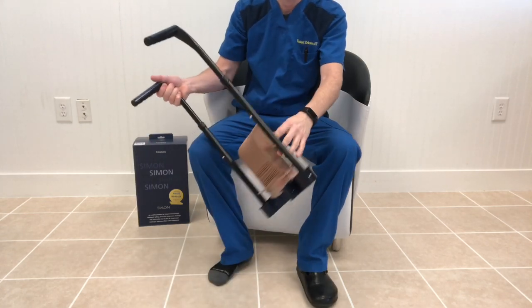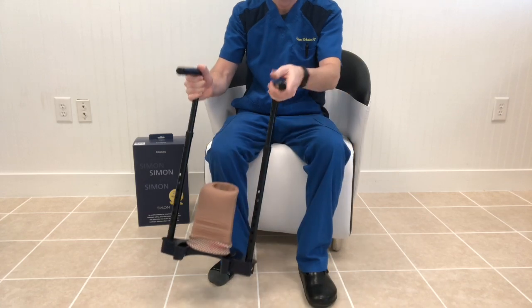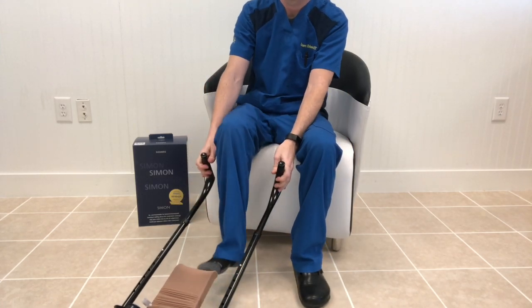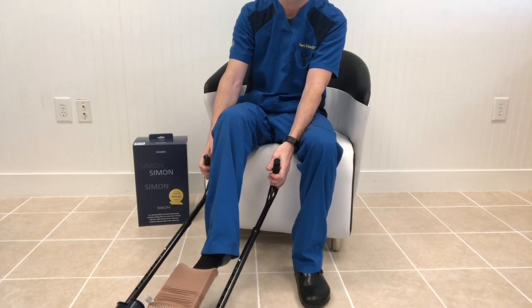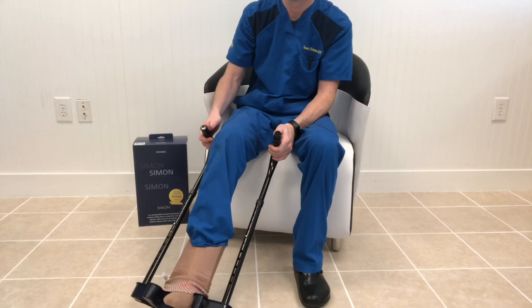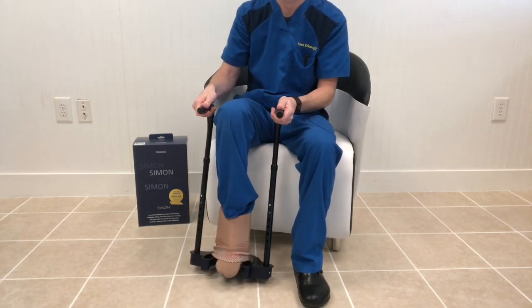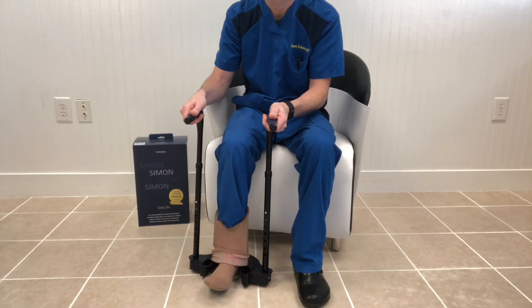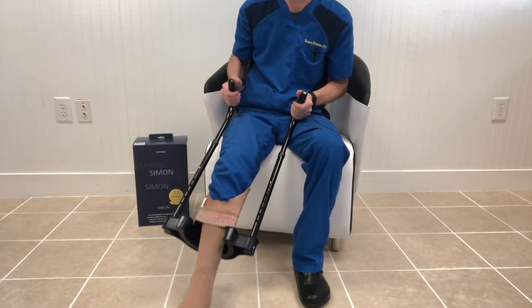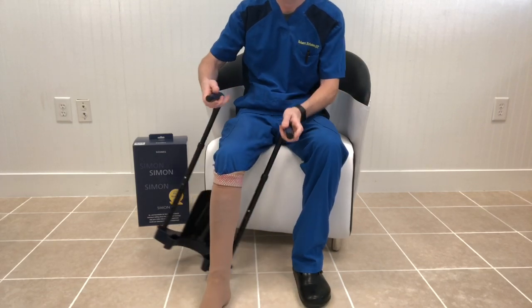So now you want to adjust the handles to the length that you desire. Once you've done that, you just stick it out. Depending on how much you can point your toes, you may need to lay the device down somewhat towards the floor like this, or far away from you. That will keep you from having to flex your ankle quite as much. There are two ways then to continue to push. You can either pull like that, or you can push down towards the floor like I did there.